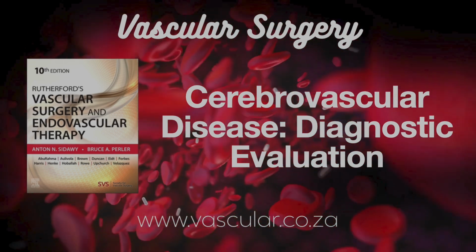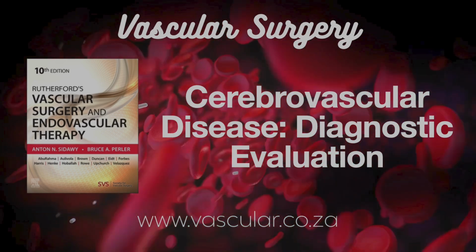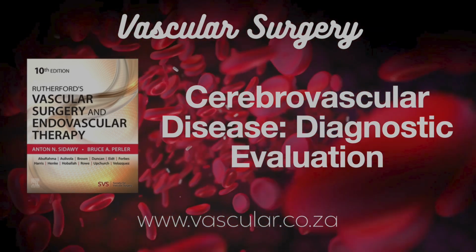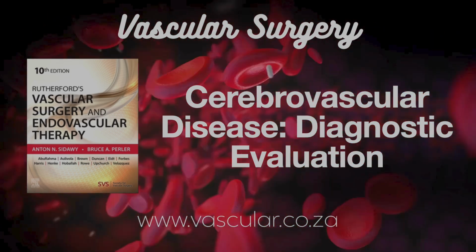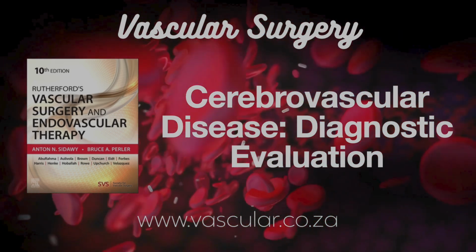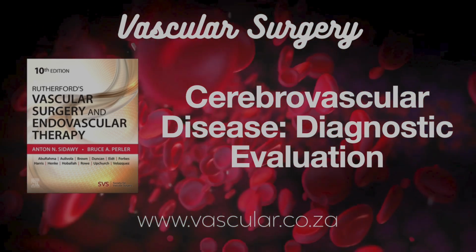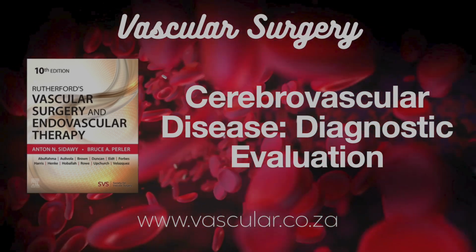CTA, in particular, is becoming more and more important with the rise of stenting, especially TCAR. And the overall impact is that having these tools, especially readily available DU, allows for really rapid, safe, and accurate evaluation, speeding up diagnosis, and getting patients the right treatment faster. It's a really impressive toolkit, a multifaceted approach with DU leading the charge, but sophisticated backup when needed.